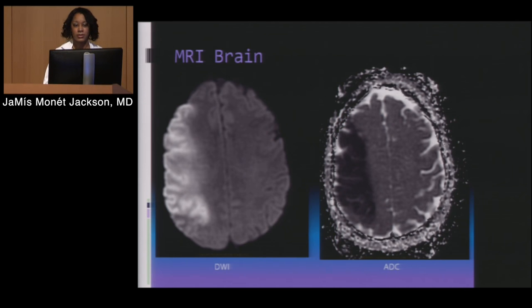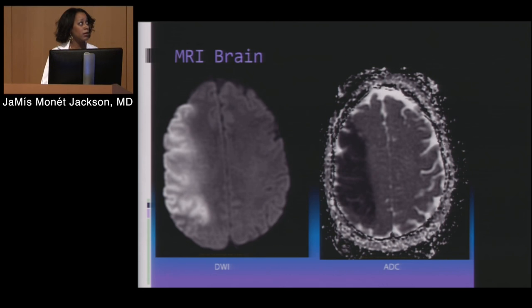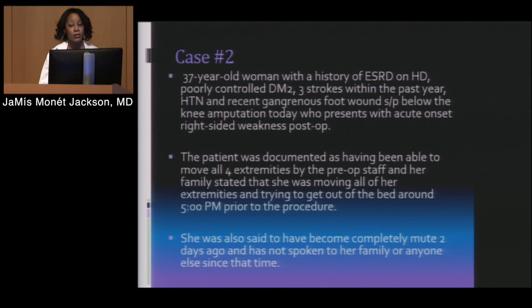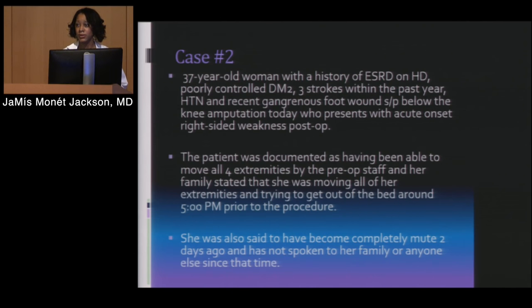This is an MRI. These are the imaging modalities and sequences we look at. Because of the clot, the patient ended up having ischemia showing up on both DWI and ADC sequences. This is the modality able to tell us with more sensitivity that the patient has ischemia to the brain because of a stroke. That patient was picked up the next day by the day team — she wasn't within any window to get intervention at that point.